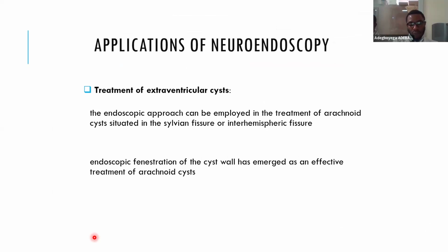The endoscopic approach has also emerged as an effective treatment for the management of extraventricular cysts. Endoscopic fenestration of arachnoid cysts in the sylvian fissure or interhemispheric fissure has expanded the treatment options for the management of this condition.